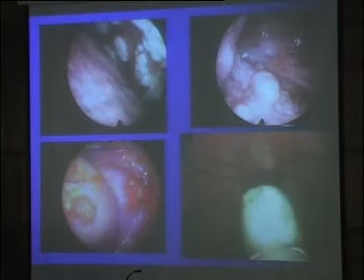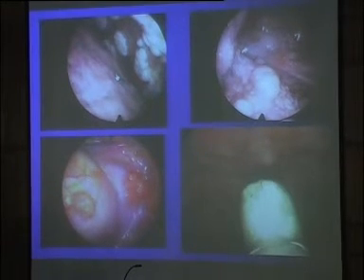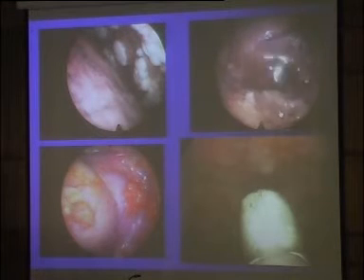And then sampling this area, but he had also few nodules in this location. It was managed, and you see this patient had on the CT scan non... with recurrent malignant pleural effusion.